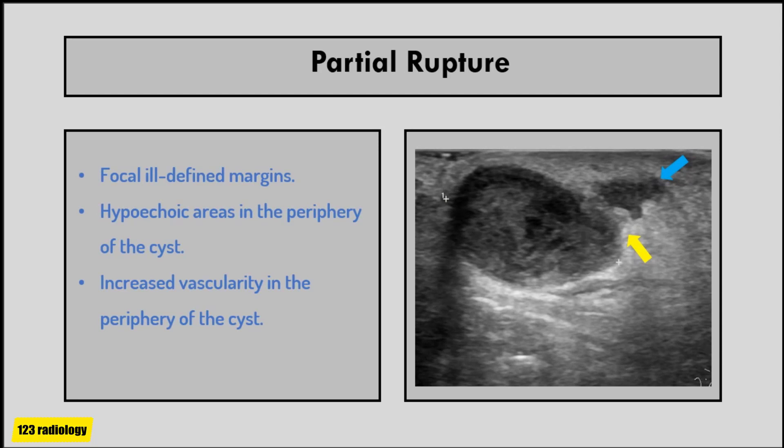If rupture occurs, keratin spreads into the surrounding tissue, leading to reactive inflammation which causes a surrounding hypoechoic fluid collection. In partial rupture, there will be focal disruption of the cyst wall. The yellow arrow points to the focal wall disruption and the blue arrow points to the leaked hypoechoic content outside the cyst.